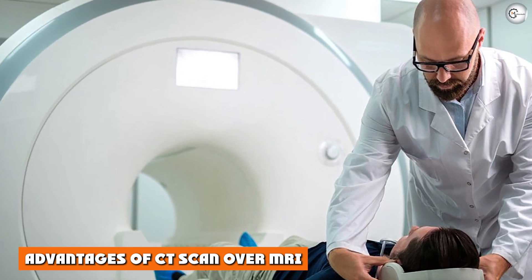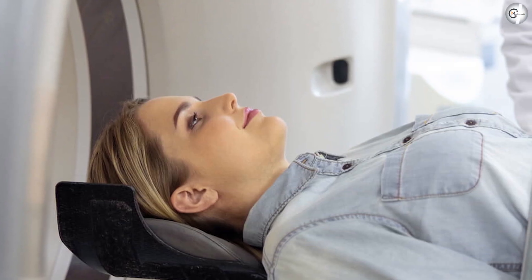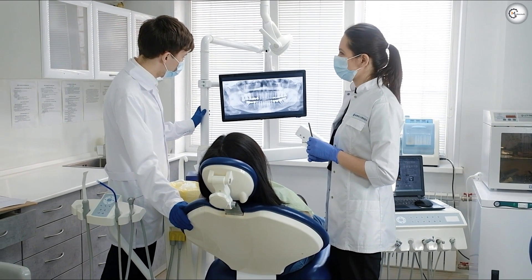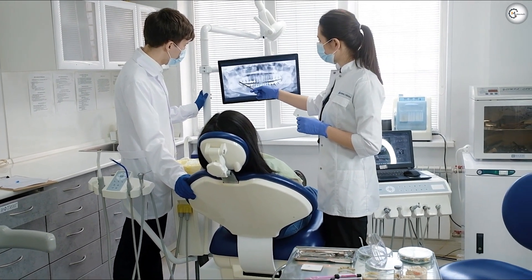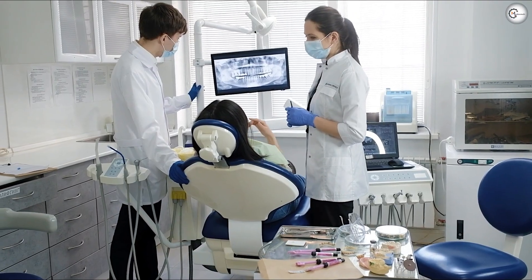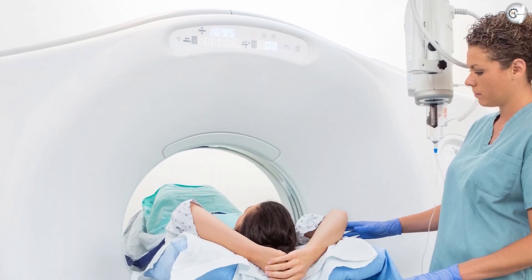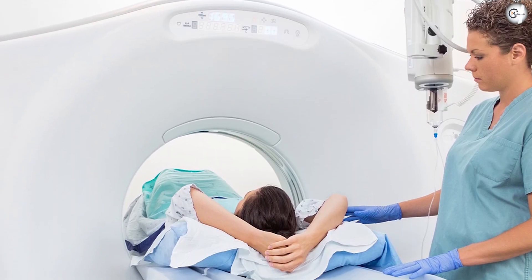Advantages of CT scan over MRI: CT is very good for imaging bone structures. Some patients who have received certain types of surgical clips, metallic fragments, cardiac monitors, or pacemakers cannot receive an MRI. The time taken for CT testing is shorter than MRI. MRI cannot be done on patients who are claustrophobic, as the patient must remain inside the noisy machine for about 20 to 45 minutes.